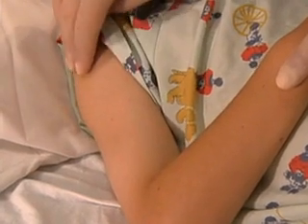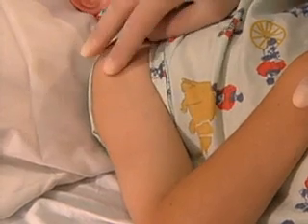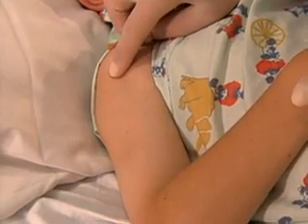just anterior to the midline of the lateral shoulder and distal to the shoulder joint. This bony prominence is the insertion site.